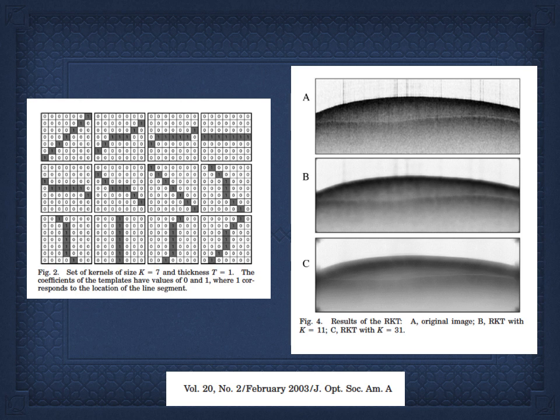What you do is, if you're just looking at one pixel, there's a chance that you're going to end up with a lot of error, scattering, noise, a variety of things. So what you do is you create a stick. If we look in the upper left-hand corner, we have a stick of 7. We take that and use for the center pixel the average of all those pixels. Then it's rotated, and this occurs very quickly with the computer. Now we have another average for that center pixel, and you rotate it all around. Then the net value is what you assign that pixel in the image. This removes a lot of the noise.